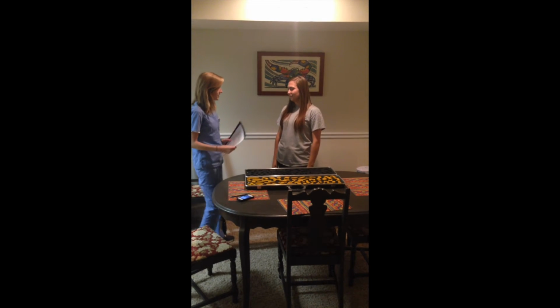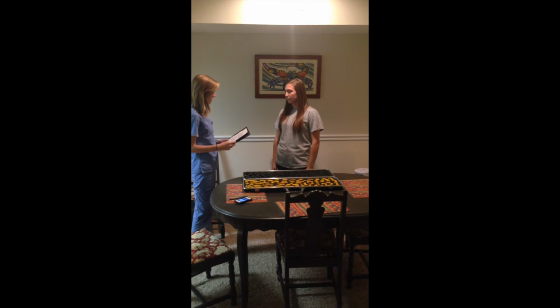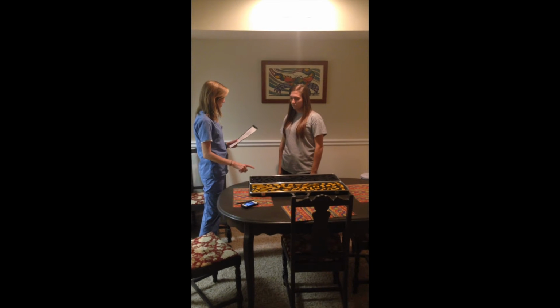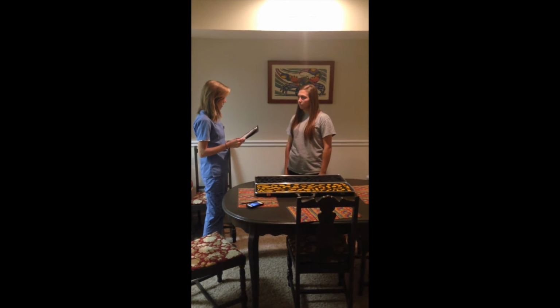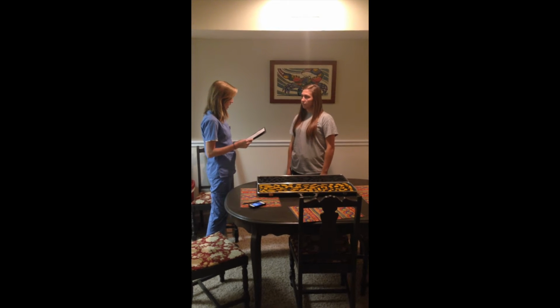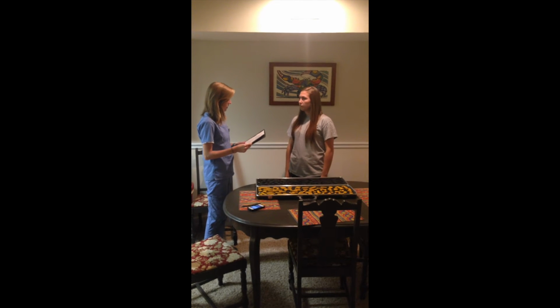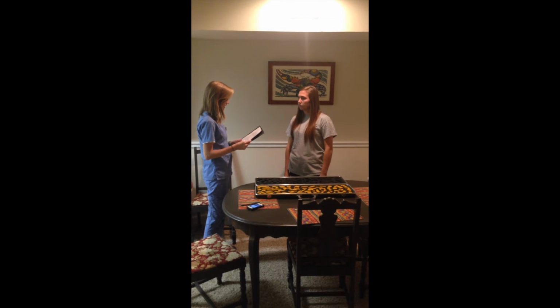Good. Alright, today we're going to be doing the Minnesota Spatial Relations Test, and what you're going to do is remove the blocks from this board, one at a time, and put them into their proper place on this board. They fit easily, so do not force them. You may have to turn some of the blocks around, but do not turn any of them over. Keep the yellow side of the blocks up. If you cannot find the right place for a block, set it aside, try another one, and then come back to it later.